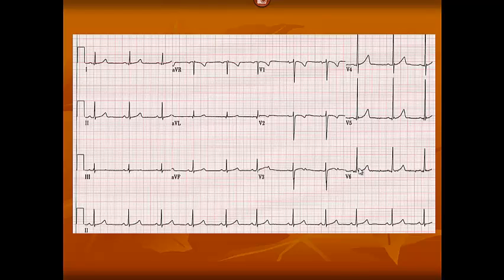However, certain conditions such as 3rd-degree AV nodal block or ventricular tachycardia can alter this normal relationship, causing an AV dissociation. In this setting, the atrial rate, P waves, and ventricular rate, QRS complexes, are at different heart rates. One quick and easy way to measure the ventricular rate is to examine the RR interval. That's the distance between 2 consecutive R waves.